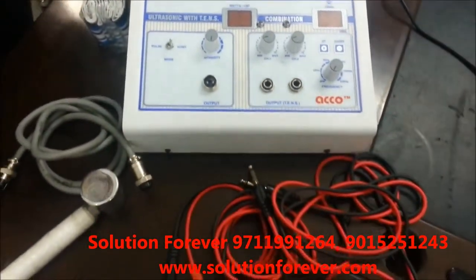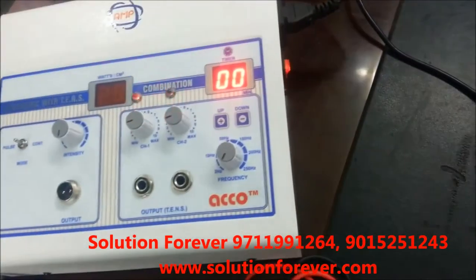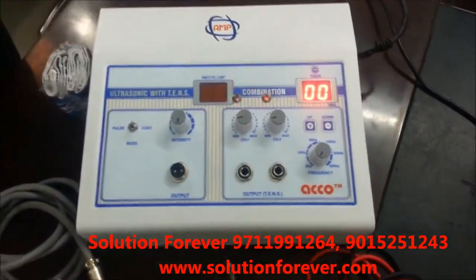Now we will show you the demo of Acco Combo TENS and Ultrasound Therapy Unit. Switch on the machine. Firstly we will show you the demo of Ultrasound Therapy Unit.